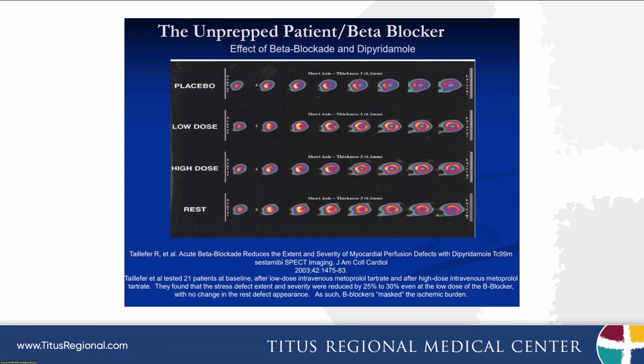All right, let's talk again a little bit about the importance of preparation of the patient for stress testing. This is an interesting study that was published a couple of years ago. On the top line that you see on the screen, you're going to see a patient who was given a normal Lexiscan stress test, or in this case, they used dipyridamole instead of Lexiscan, but a similar agent. And on the bottom line, you're going to see the resting imaging of that patient.